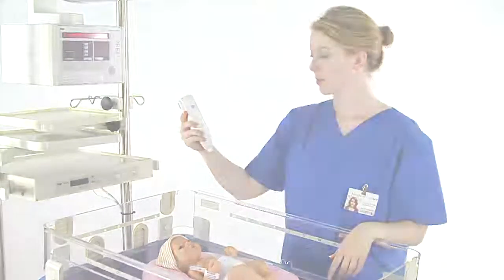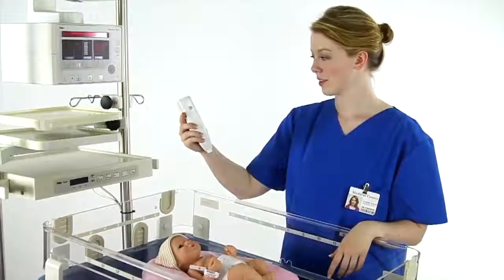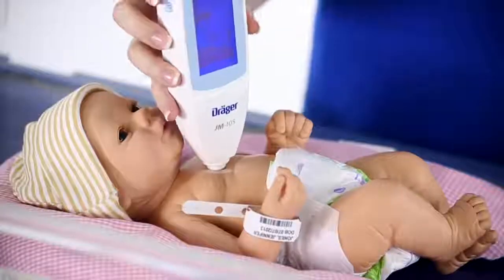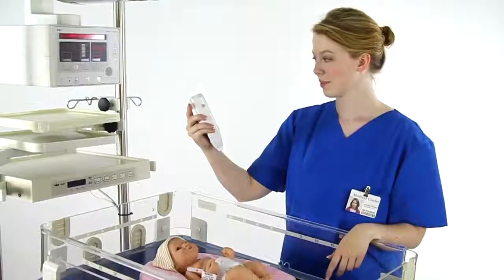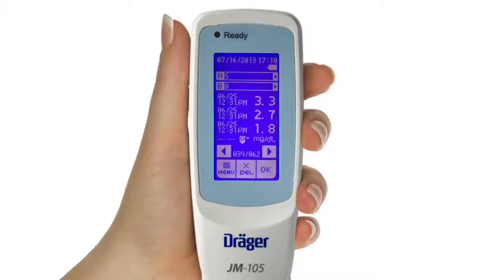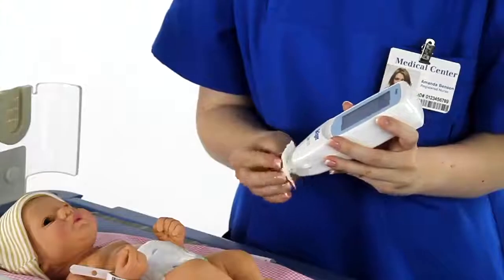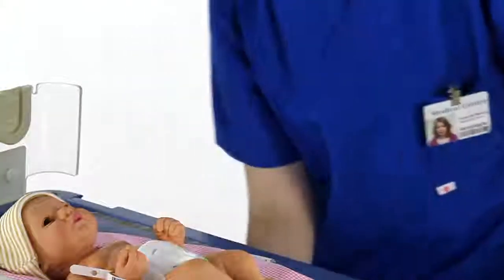After taking the first reading, the screen will display N4 to show that 4 more measurements must be taken for averaging. Lift the probe from the skin between measurements and wait for the green ready light before taking the next reading. After each reading, the N number will be reduced by 1 until you have completed all 5 readings. After the last measurement, the final averaged value will be displayed. All of the measurements must be completed to get a final averaged value. When measurement is completed, clean the probe tip with an alcohol swab and return the JM105 to the docking station.